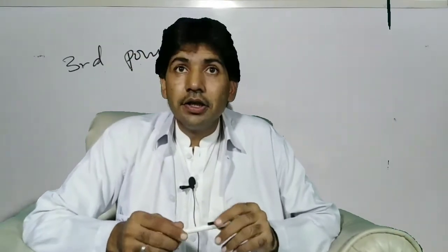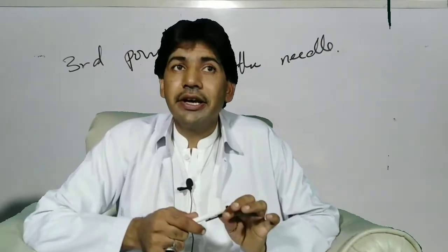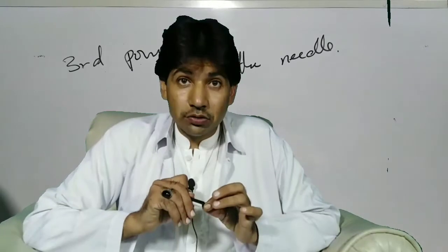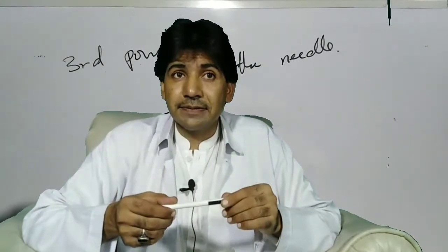Then the third point is about the needle. We have to use a long needle. You have to use a 25 to 27 gauge long needle, and when we inject, the needle must go 20 to 25 mm. Then we have to inject.